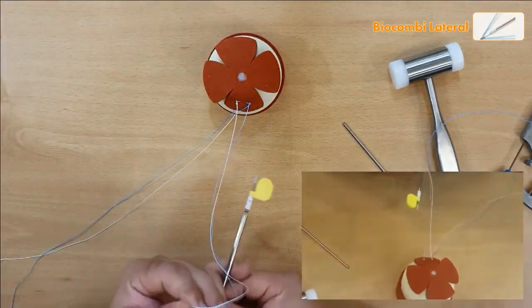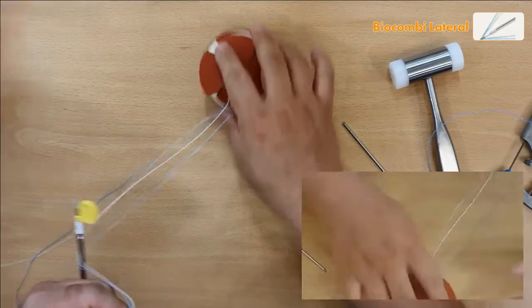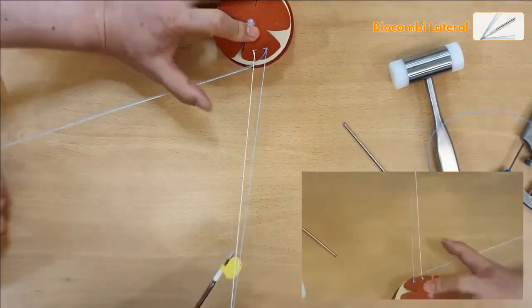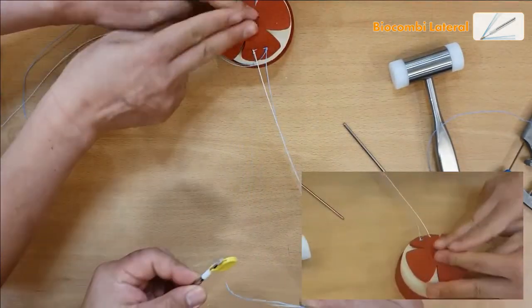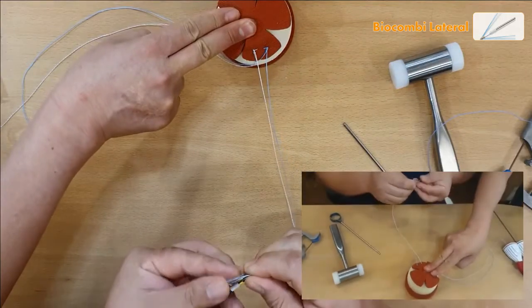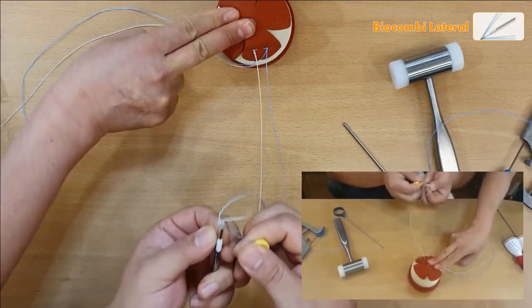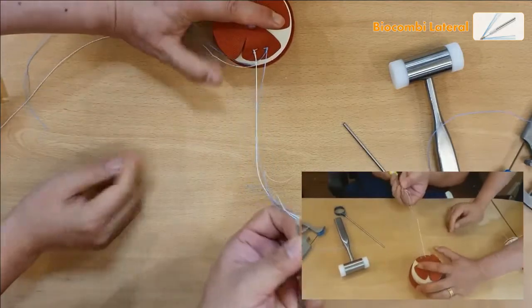This is the Biocombi lateral, the Heelmax type. Same as other anchors with eyelets. This is self-punching, so you don't need to tap it.